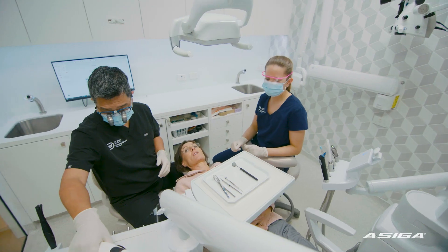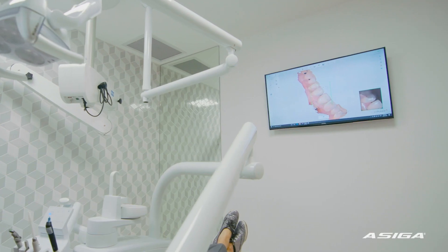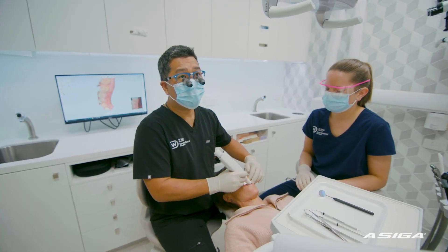We've got our own in-house lab with our own in-house ceramist. We started digital dentistry over about a decade ago and we had our first Asiga printer, and that really changed the whole scope of being able to deliver in an efficient manner.